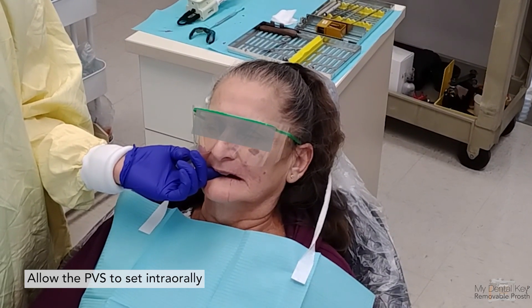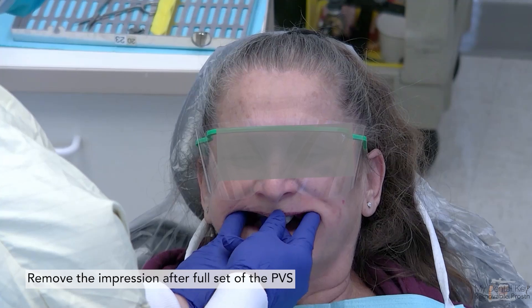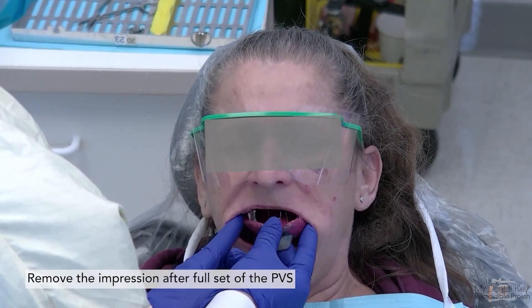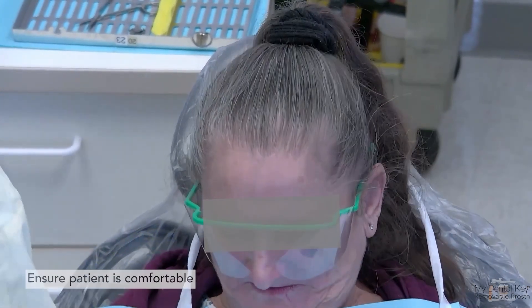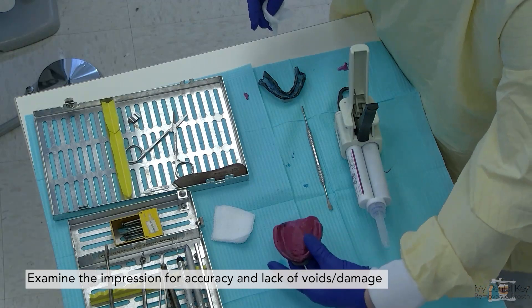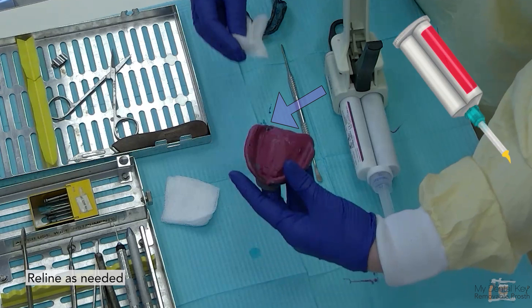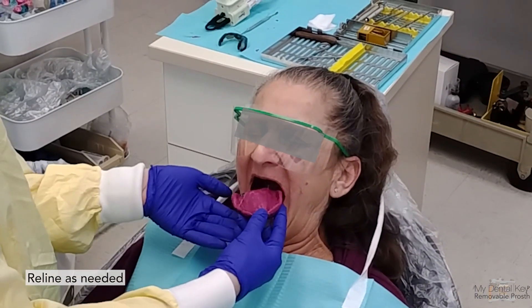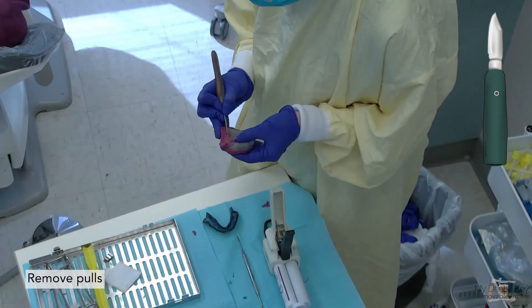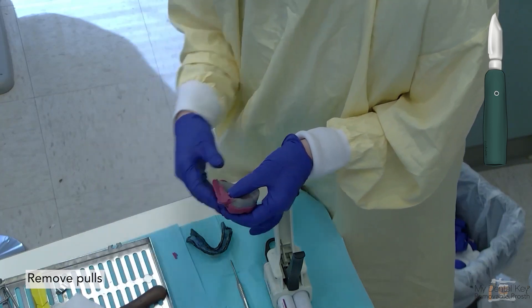Upon full setting, the PVS will no longer be shiny or sticky — now remove the impression. It should be retentive on its own, so you will need to break the peripheral seal or suction to remove the tray. After ensuring your patient is comfortable and has rinsed out, inspect the impression — there should be no voids or flash. If there is a very small void, use a small yellow applicator on your PVS gun, apply a small amount of PVS to the void, contour with your spatula, and reinsert the tray to set. If there is a pull, cut it out with a scalpel and perform the same small addition of PVS to the trimmed area.